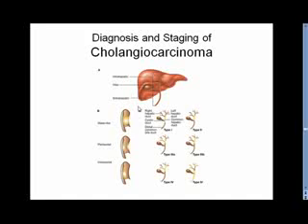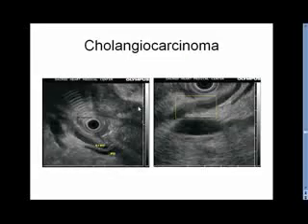especially in the setting of primary sclerosing cholangitis, where you have strictures which are by and large benign, but then occasionally you get a stricture which becomes malignant, and endoscopic ultrasound can contribute to the evaluation of these patients. But as you know, only recently, with the advent of cholangioscopy with the SpyGlass equipment, do we have another instrument or another modality to specifically evaluate cholangiocarcinoma. Nevertheless, endoscopic ultrasound remains a very valuable component of the overall workup.